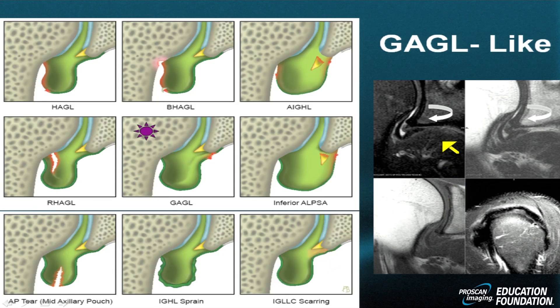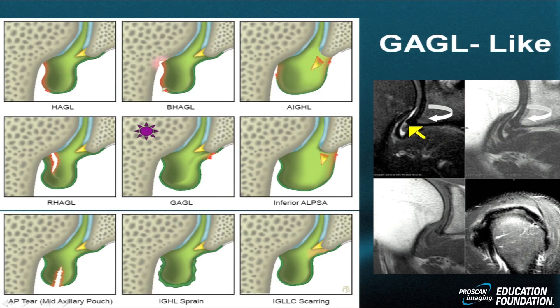Look to the right and you'll see a GAGL-like lesion. There is preservation of the neck attachment of the inferior glenohumeral ligament. But as we move over to the glenoid side, there is detachment — with one caveat: the labrum is also involved. The labrum is ever so slightly separated from the adjacent cartilage, making it a GAGL-like lesion. Remember, in a GAGL the labrum is allowed to swell, but it shouldn't displace.